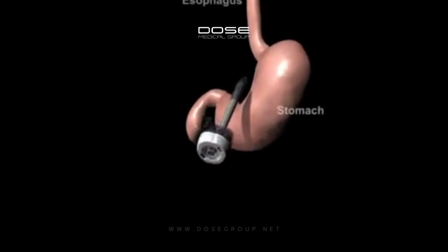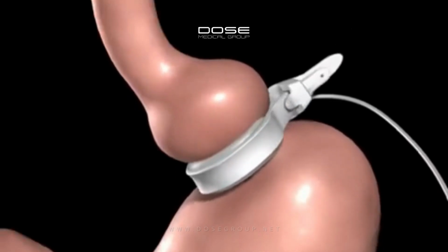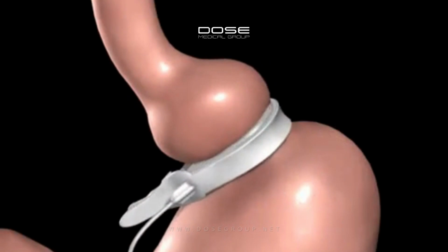In preparation for the band, a tunnel is created behind the stomach. The Realize band is introduced to the abdomen through a trocar. The Realize band is positioned around the upper portion of the stomach and then secured using the locking mechanism.